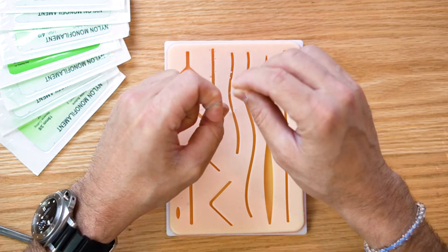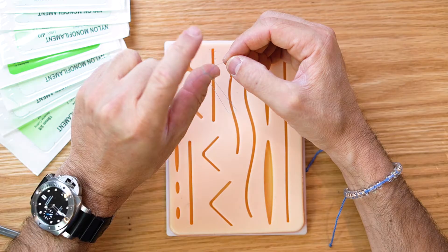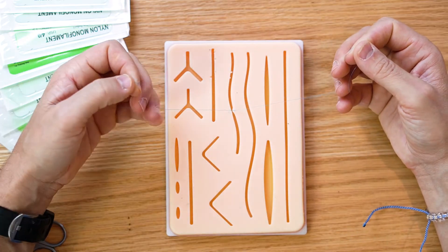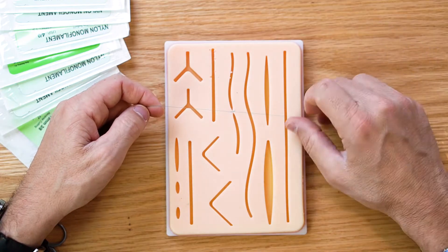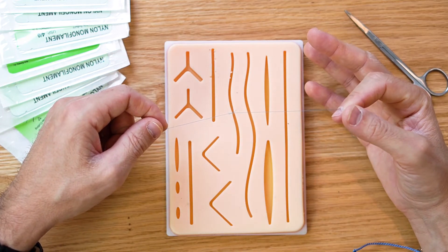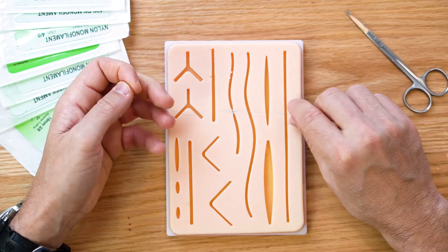First thing you do is cross the suture. You're going to hold the sutures like this — this is going to be a two-handed tie. Cross the suture like this. You're going to make an X on your index finger, put these two fingers together, and slide the thumb through. Now you have the X sitting on the thumb. Then all you do is put your finger on top of that suture and do the same maneuver but backwards, going this way — and so then we have our first tie. Pull this down like so. If you do the same tie twice, it's going to come down but not form a tight knot you can't move. I'm going to do the same one — go like this and like that — and this should pull all the way in.